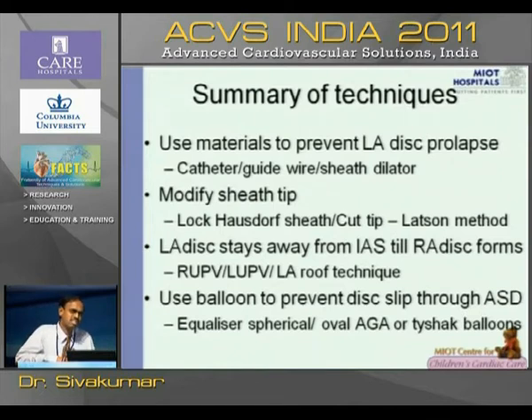We are having concerns about what radio frequency for atrial fibrillation is going to cause for the pulmonary veins, and just imagine a macro device of 38 millimeter just going and occluding the pulmonary veins for about 15 to 20 seconds before it is deployed. So we do have a concern about all the thin-walled structures, the pulmonary veins and the left atrial roof.